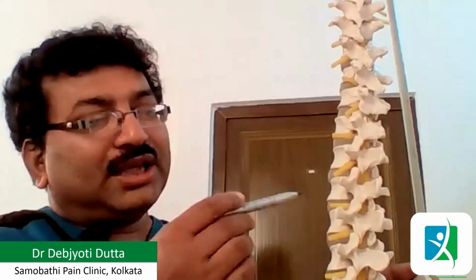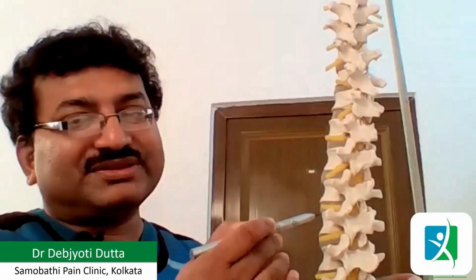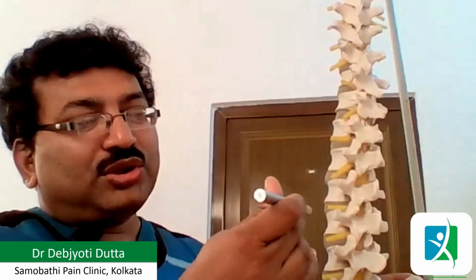oblique. And as you can see in this picture, we are making it oblique such that the transverse process comes within the vertebral body. So if your patient is sitting and we are taking an AP view from the back, it will be like this. Now if he rotates, that means we are making the C-arm oblique. Now in this position, you can see the transverse process is within the vertebral body. So if we go by making a tunnel view like this, we will reach the area. So we are going to do exactly the same in the C-arm.